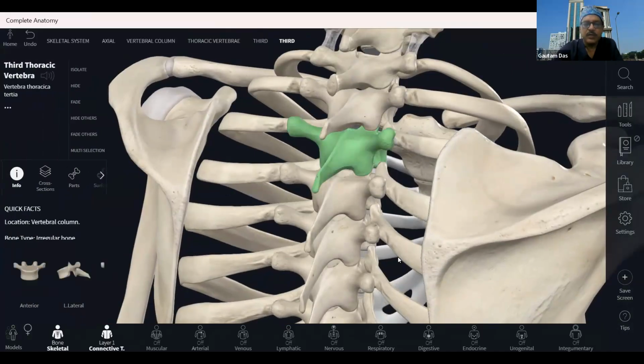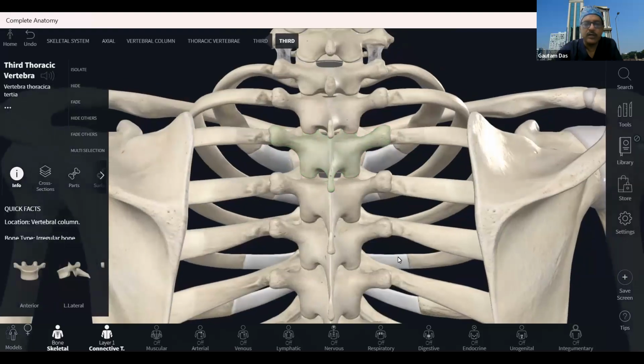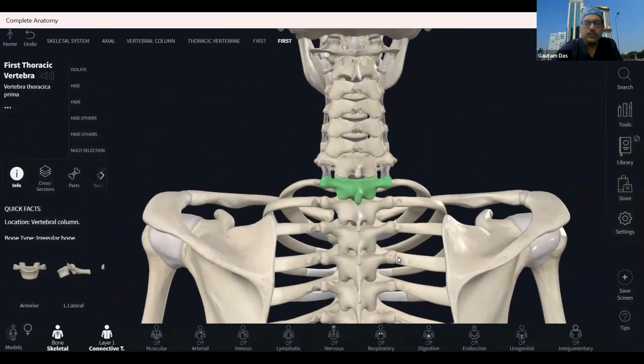And then as you hold the probe in the long axis, just lateral to that will be a sudden dip. This area will be hosting the multifidus muscle, and above that there will be the spinalis muscle. And then there is a curve. So this part is elevated till the transverse process, which is most elevated.